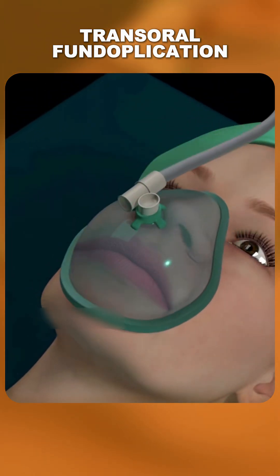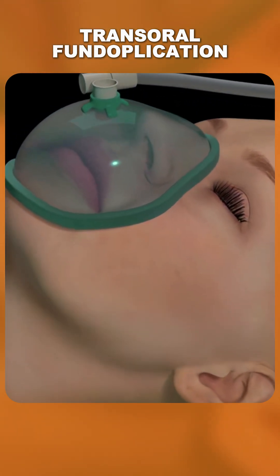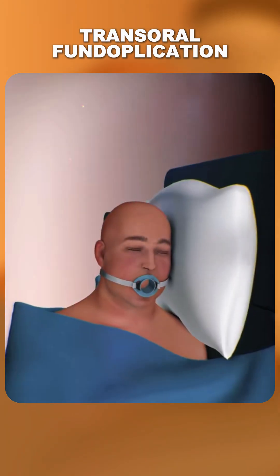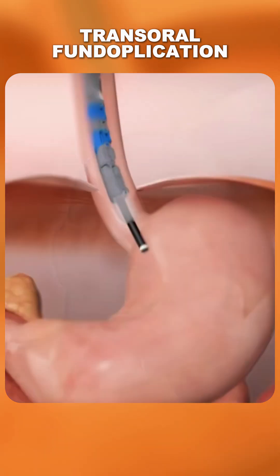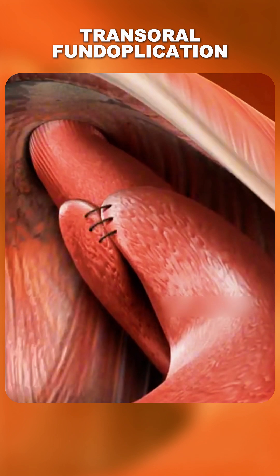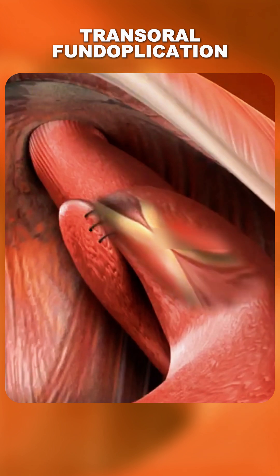The process starts with giving the patient general anesthesia to make sure they feel no pain. Then, the surgeon inserts a flexible tube with a camera and special tools through the mouth and down into the esophagus. Using this device, the surgeon folds and fastens the upper part of the stomach around the lower esophagus, creating a new valve that prevents stomach acid from flowing back up into the esophagus.